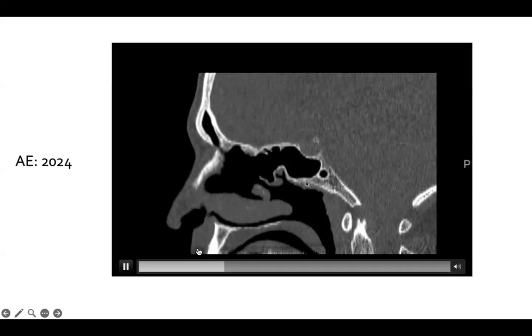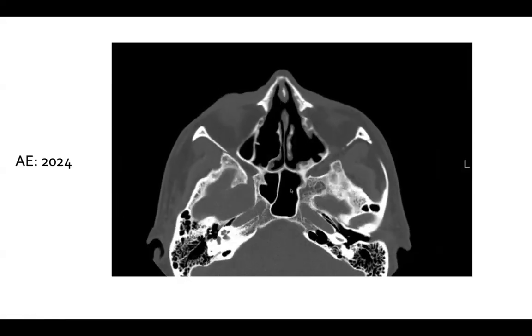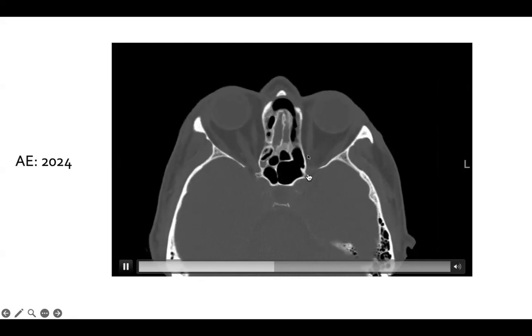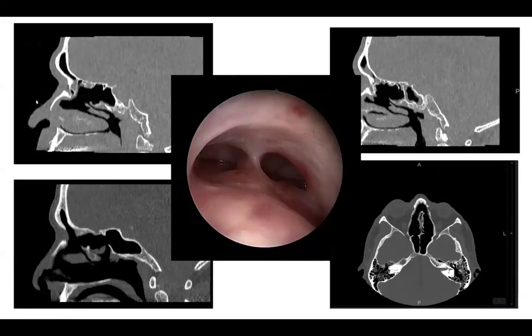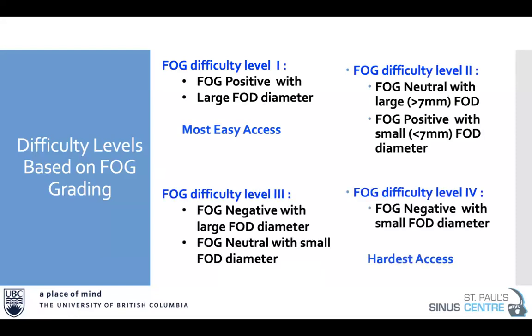And so I am one of those very conservative surgeons who will only do a Draf 3 if my primary cases fail. And you can see this is a beautiful Draf 3 that has stayed open. And this, I took a picture of his frontal recess yesterday, and it's nicely mucosalized and completely clear and free of infection.